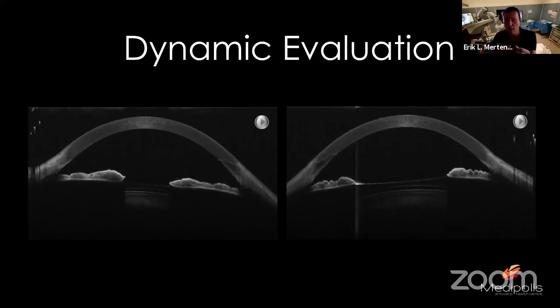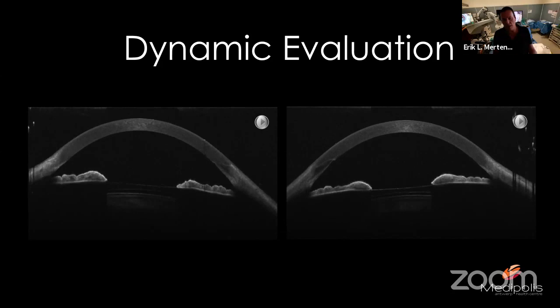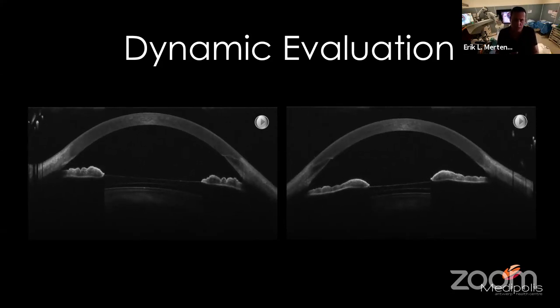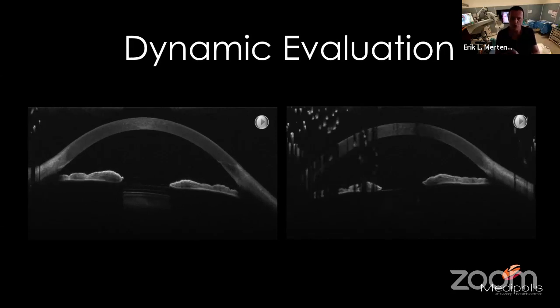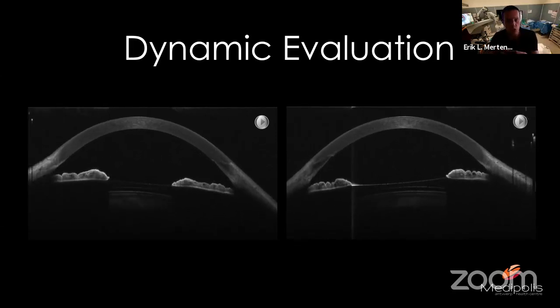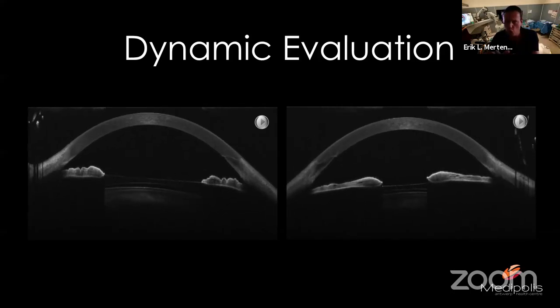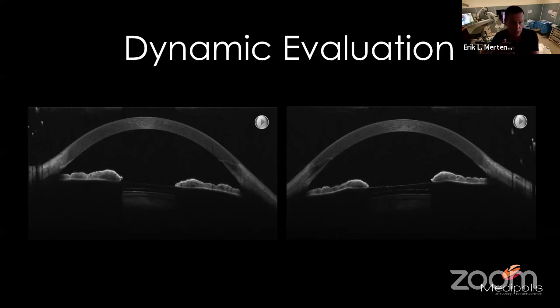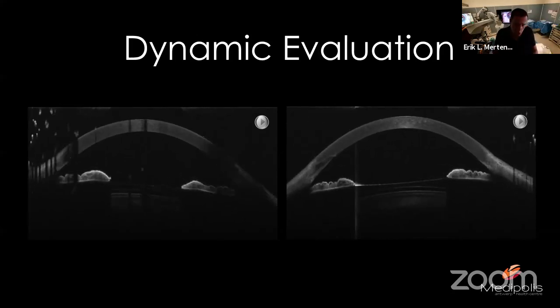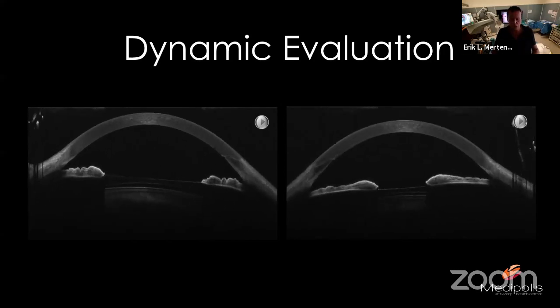The thing is, with the newest version, the Aquaport, from the ICL V4C onwards, it's not a problem anymore to have vaults less than 100 microns. I personally have 23 eyes with vaults less than 100 microns with a follow-up of 5 years with no lens opacities or anterior lens changes whatsoever. So lower vaults with the newer versions of the ICL is not a problem anymore.